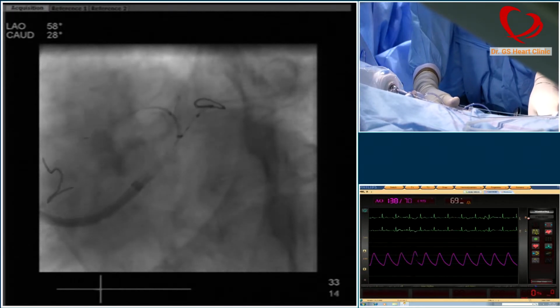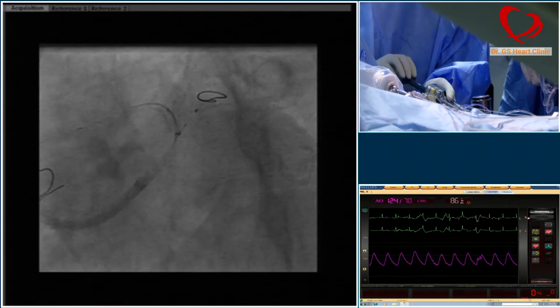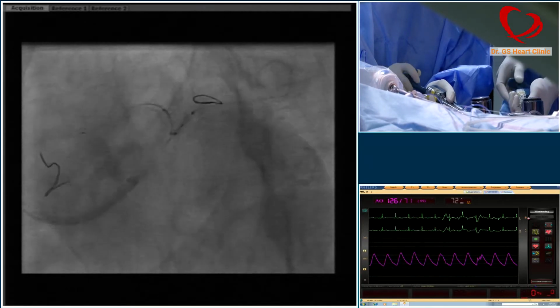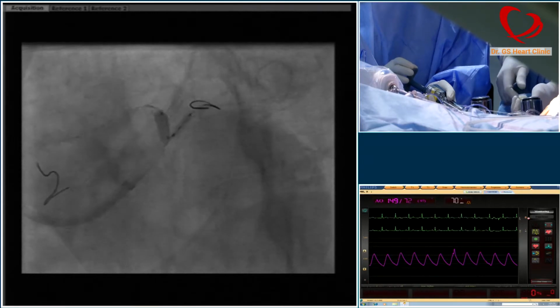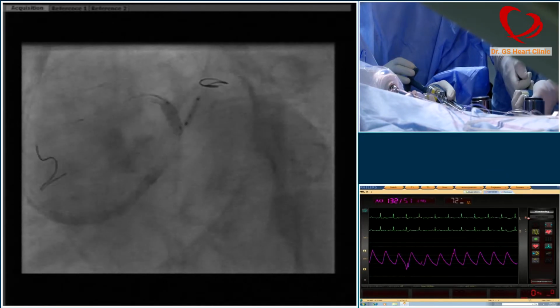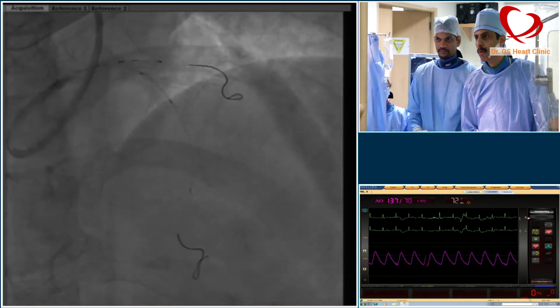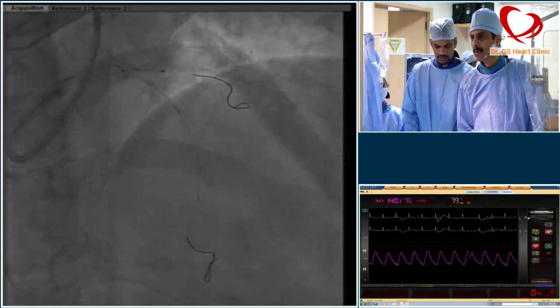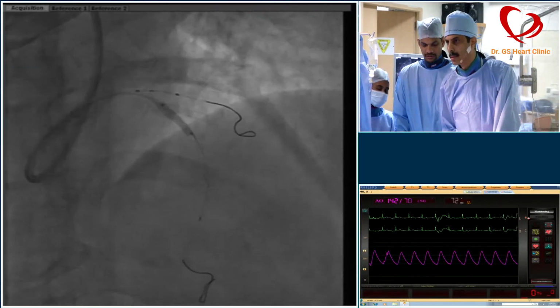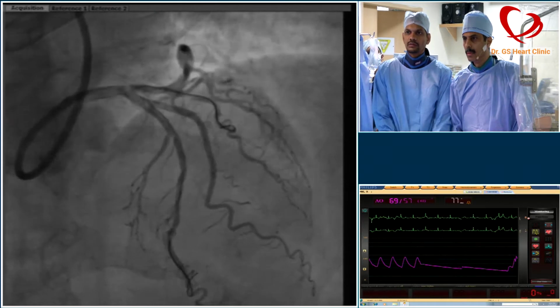Now we'll go up, 4 in the Ramus. You take only 4, and we'll go about 8, 10. Okay, go 8, 10, 12, 14, 16. Negative. 16 negative. Both negative. 4, just only 4. 6. Negative. Hold on.